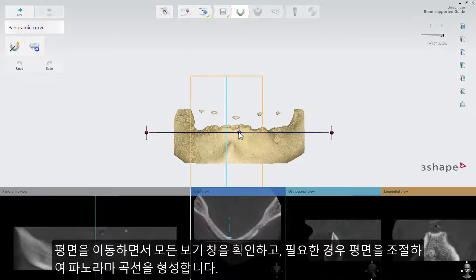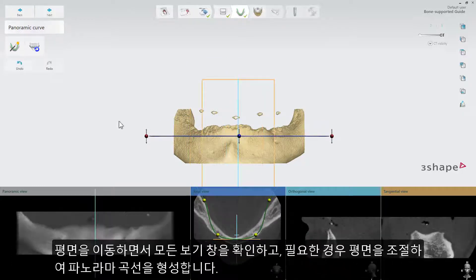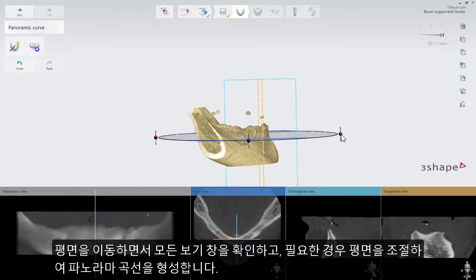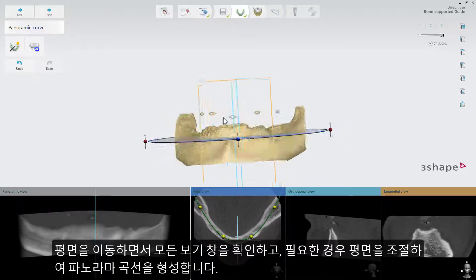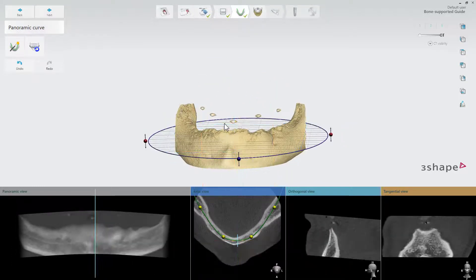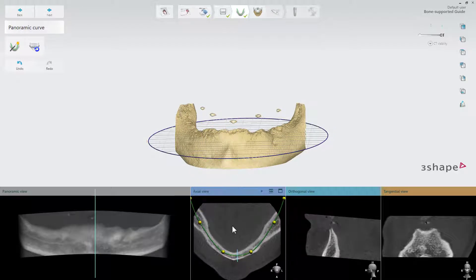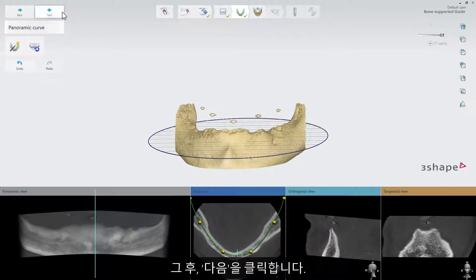Move the plane and adjust it if needed, so you will see all the views properly. When ready, click Next.